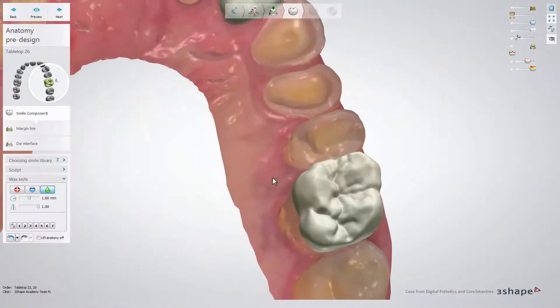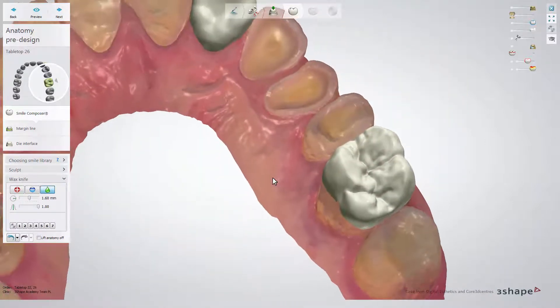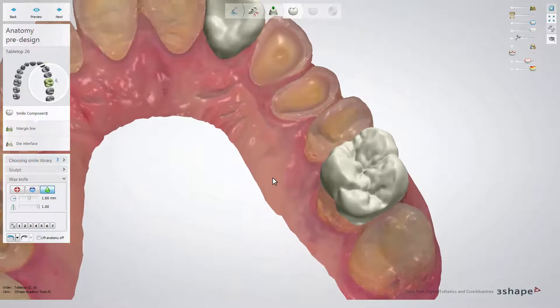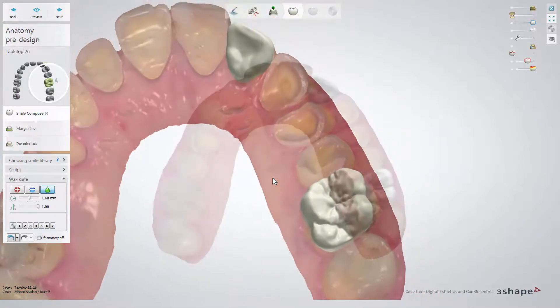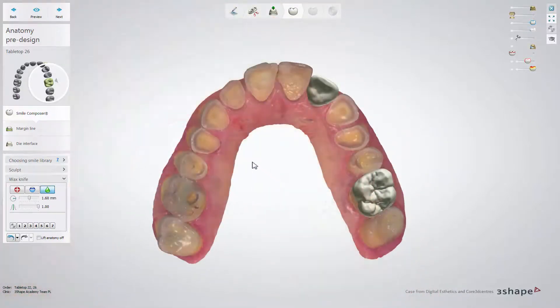When teeth are positioned and cover the surface which you wish to restore, press next.